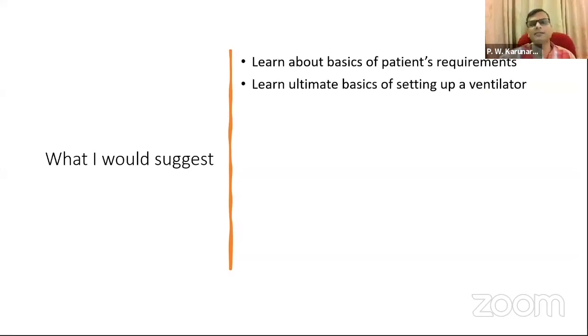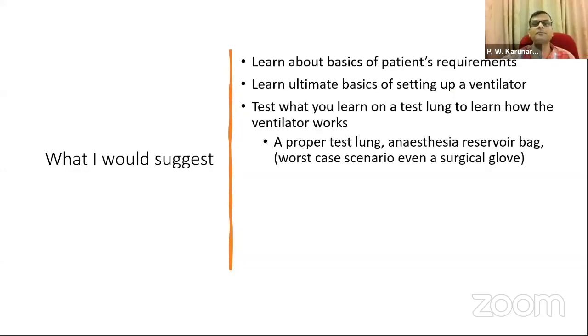I'm not going to go into fancy details, but the most important settings, because when you see a ventilator, sometimes it's quite intimidating for a novice person. You see a lot of parameters which you haven't even seen or heard, and then what to do with it. So I'm going to summarize the most important stuff so that you can forget about the rest. An advanced operator probably can change those things, but I'm going to stick to the most basic ones.